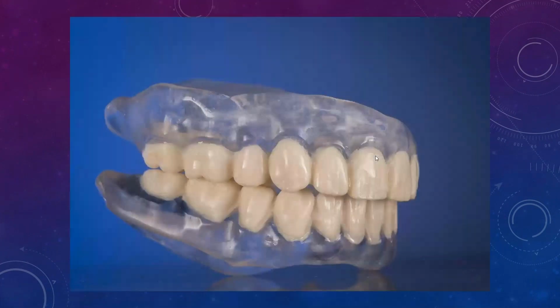But for something like this, where you have teeth that are made with some kind of radiopaque material, like in this case, I actually mixed some barium sulfate into the acrylic, these are done with a single scan protocol, where you just put the dentures in, scan it, and don't scan the dentures afterwards. I don't like doing it this way because it creates a little bit too much noise, in my opinion, when you do CT scans. So I'm a big fan of doing a dual scan protocol.